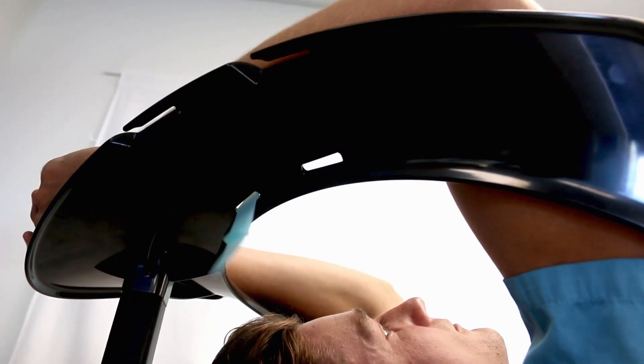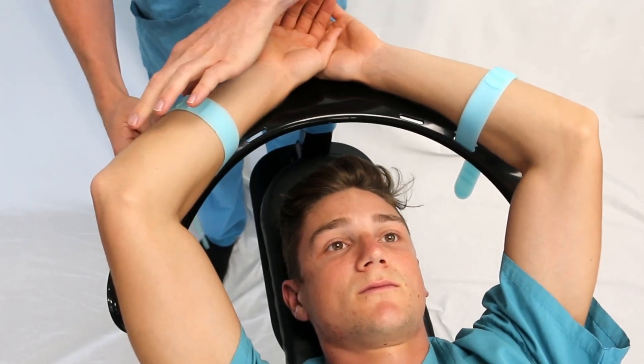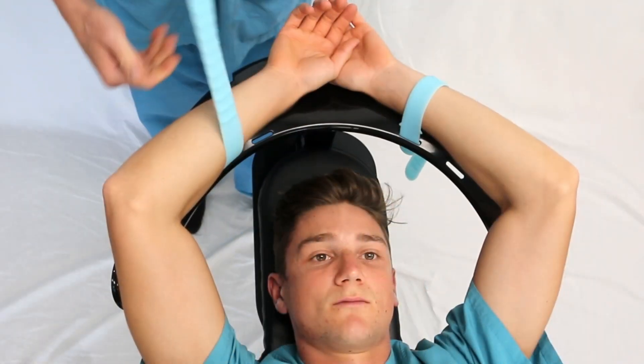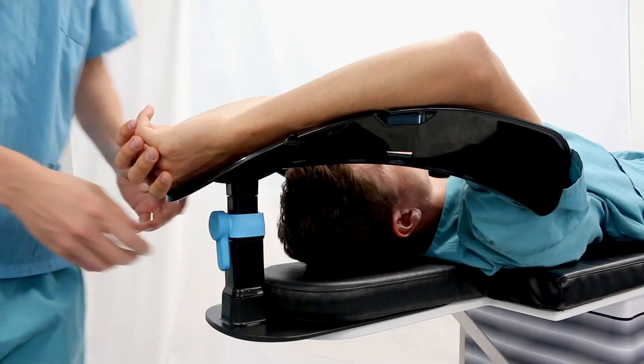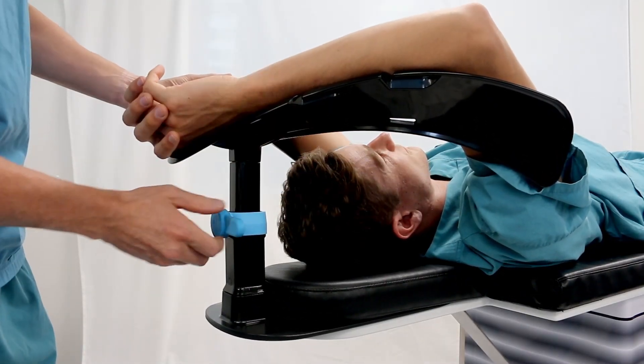The straps are easily installed and adjusted to loosely contain the patient's arm. Two strap mount locations for each arm allows flexibility when considering IV access. The patient's arms are fully supported, reducing the risk of arm displacement and aiding patient assurance and comfort.